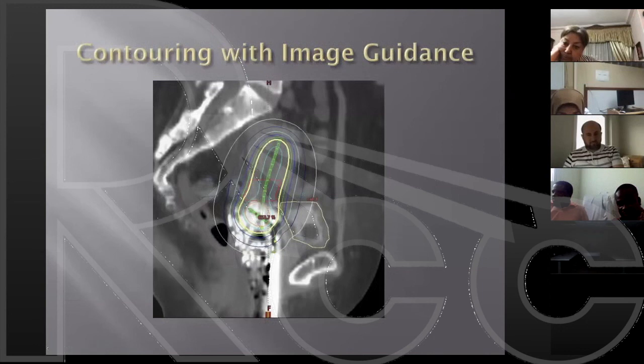Dr. Einck, can I ask one question here, which I think would be helpful for everyone. Some of the centers have the possibility of using MRI either now or in the future with their brachytherapy, also CT. How would you approach optimization differently if you're doing CT-based planning or MRI-based planning? Would you be just as aggressive with CT or less aggressive?